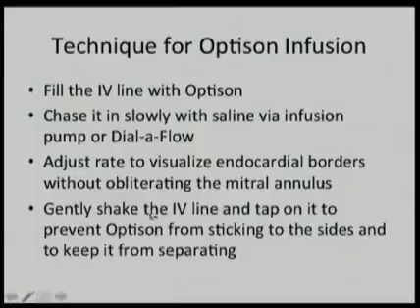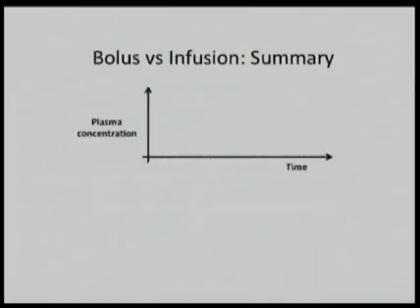What you have to do here is gently shake the IV line or tap on it with your finger to keep the Optison from sticking to the sides and keep it evenly mixed. It's not too hard to do, but you have to remember to do it.